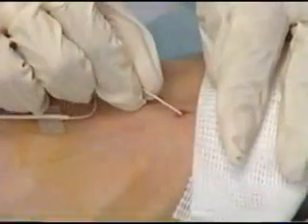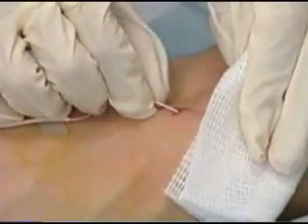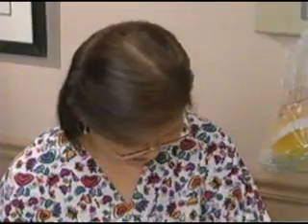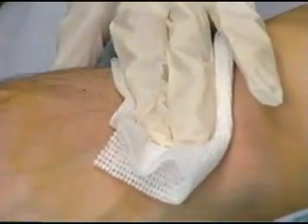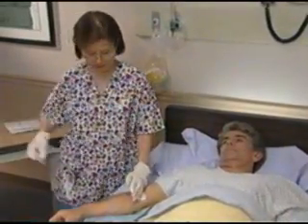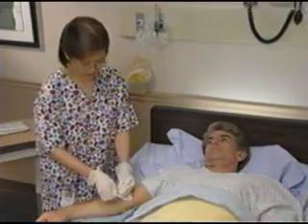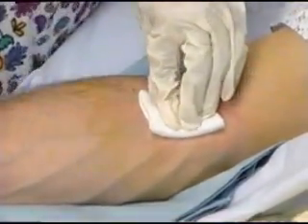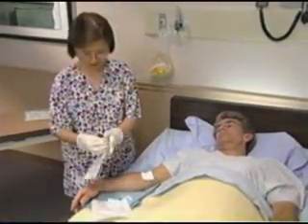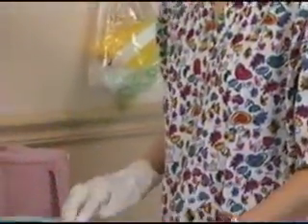Pull the catheter slowly and gently until it's completely out of the vein. Place a sterile gauze pad on the site and apply pressure for 1 minute or until the bleeding stops. Then apply antiseptic ointment and a sterile gauze dressing over the site. Redress the site every 24 hours until it's epithelialized. Finally, inspect and measure the catheter to make sure you've removed it completely.